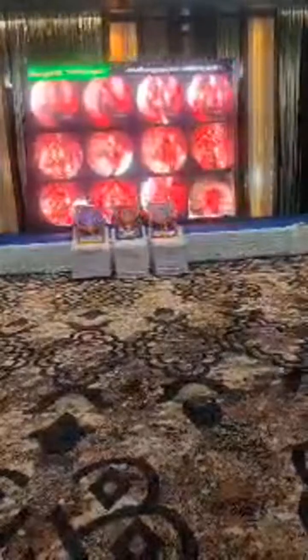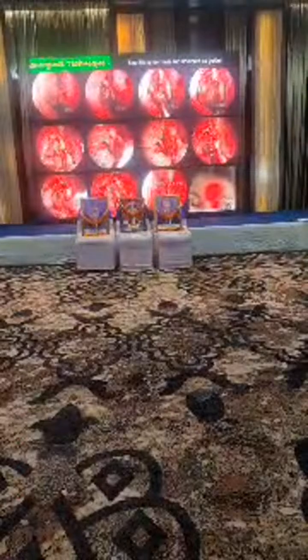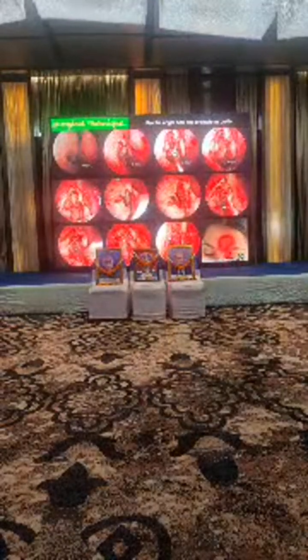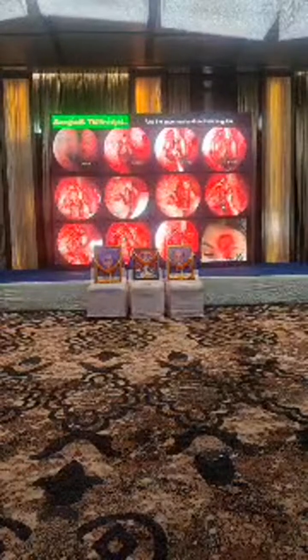Like this, identify the cells, go behind that cells, come from posterior to anteriorly, remove the lamina, remove the thin bone, remove the mucosa with the divider, and you open the big agger over there. The agger cell is being dissected. Here, after removal of the agger cell, this agger cell posterior wall. Again, posterior wall is being removed. This is the opening again, and this is the frontal sinus drainage pathway.